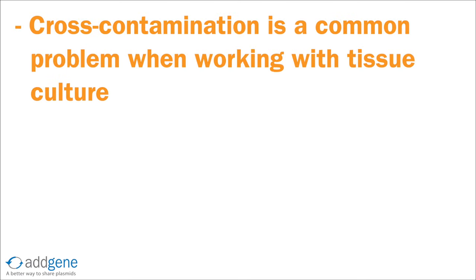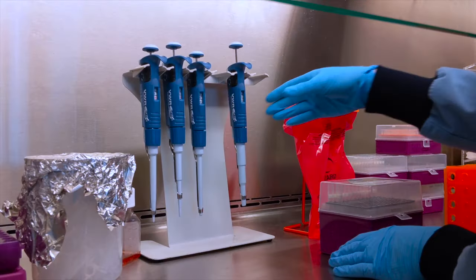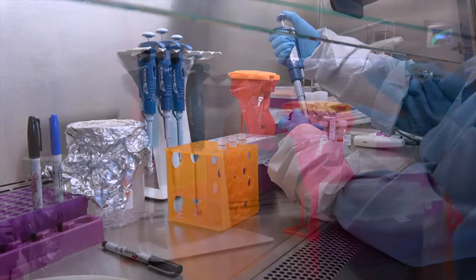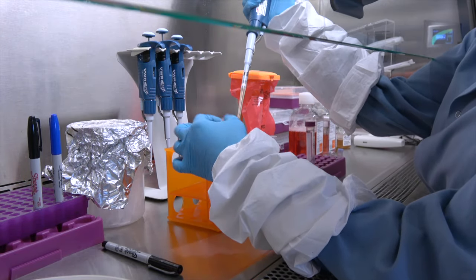In addition to microbial contamination, cross-contamination of cultures is a common problem for those new to tissue culture. To prevent cross-contamination, never work with more than one cell line in the biosafety cabinet at a time. Also, be sure to change your serological pipette or pipette tips anytime they contact your culture to ensure that you are not contaminating your media or other reagents with cells.